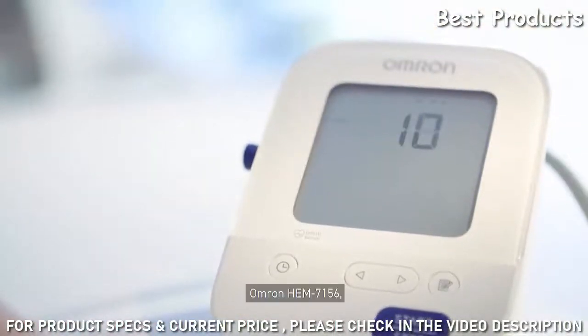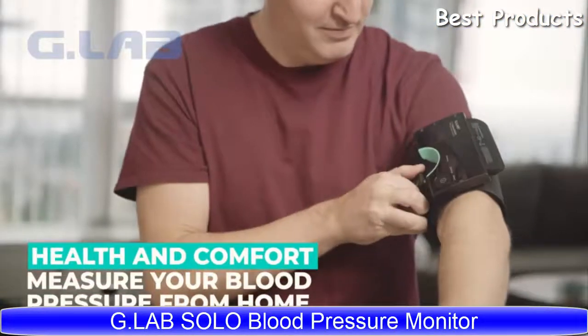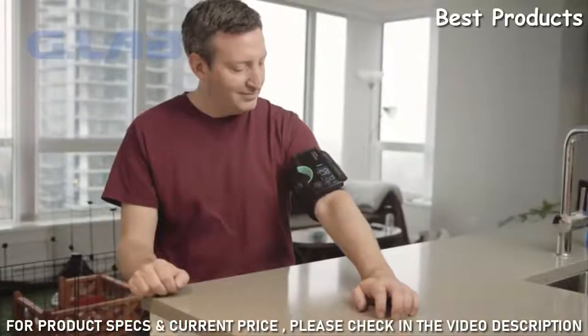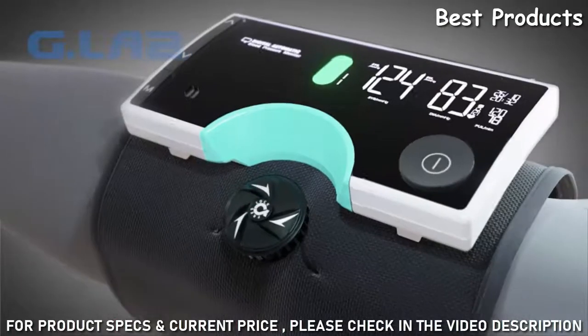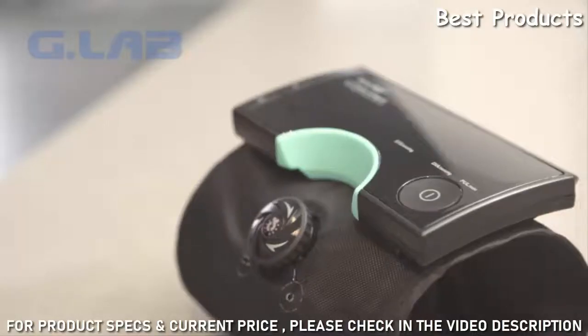Omron HEM 7156 — accurate, comfortable, intuitive. A way of monitoring your blood pressure with no tubes, wires, or clutter. The Solo is the simplest way of measuring your blood pressure from the convenience of your own home. Twist our innovative dial system to snugly but comfortably fit your arm, and in seconds you'll have your blood pressure data.